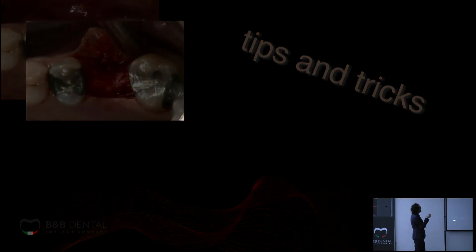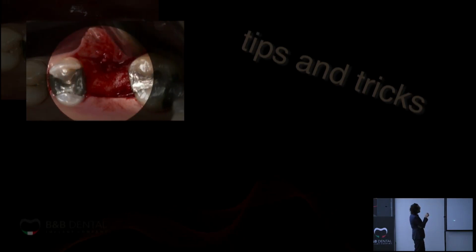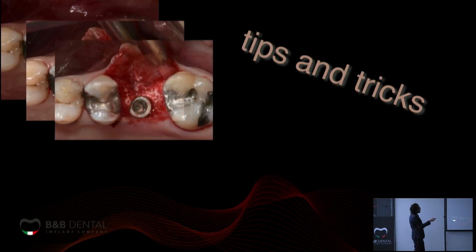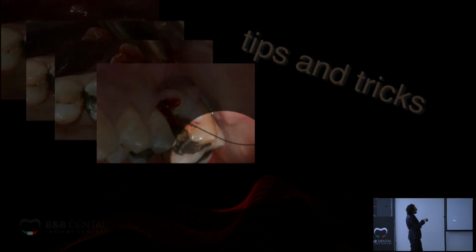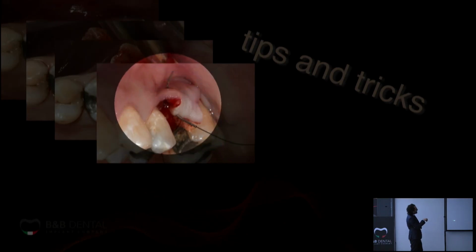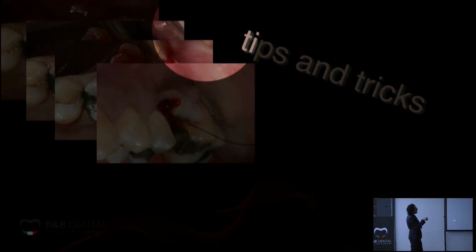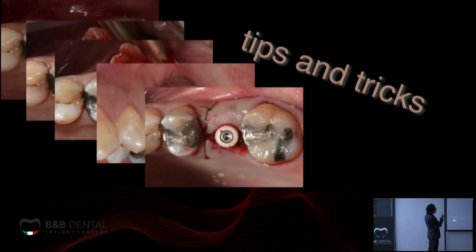So, usually the technique is with an incision that is not mid-crestal, but is a little bit palatal. Then, same protocol, we used the series, the color code expanders, until the stop. So it's very easy to use. And after that, I do this kind of suture. Actually, here we see where we enter, I tell you, but we'll see later. I enter palatal, and then I do kind of apically repositioned suture.